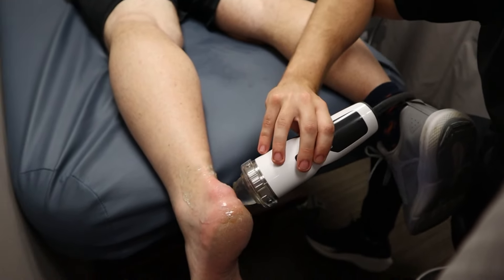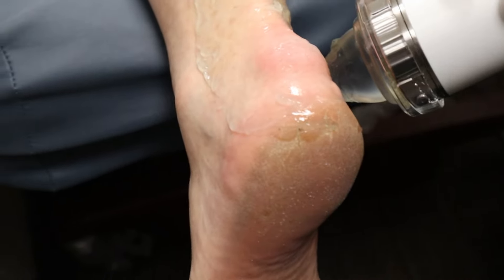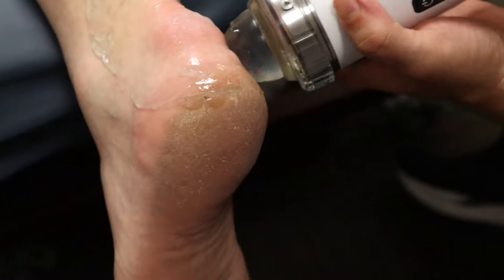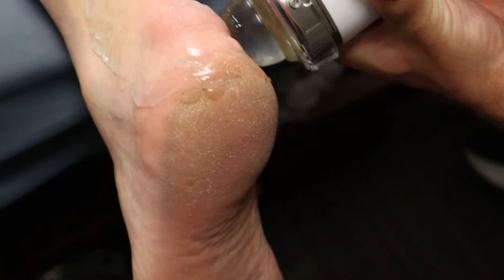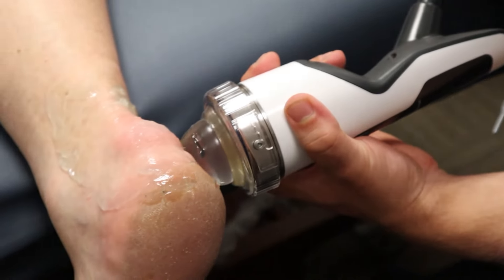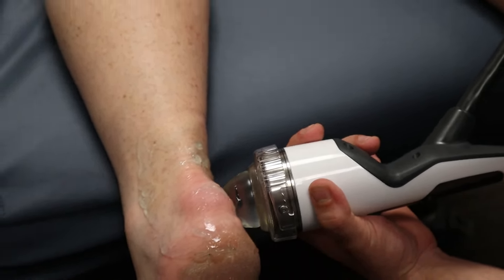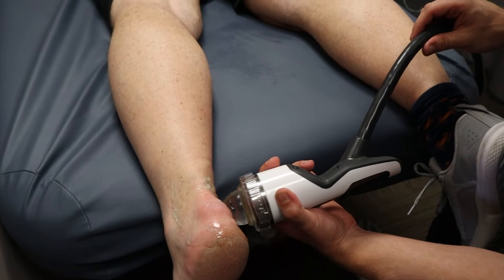I'm really focusing now for the last of the video on getting just these sides hit.